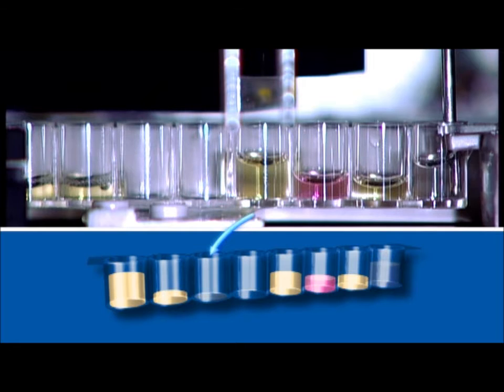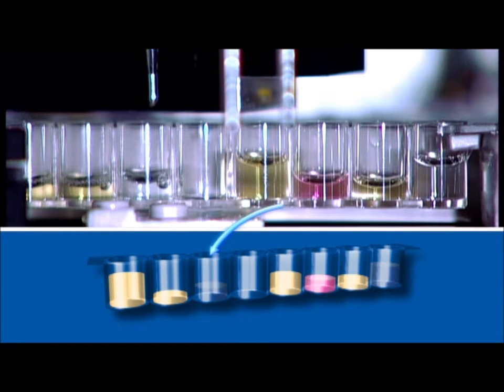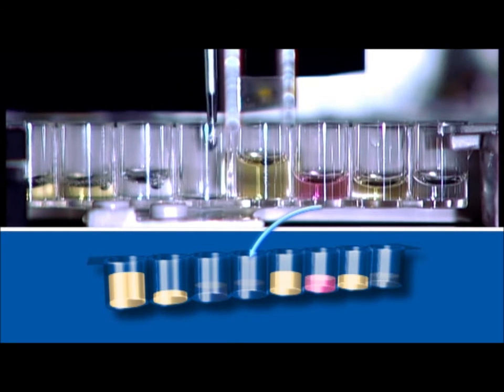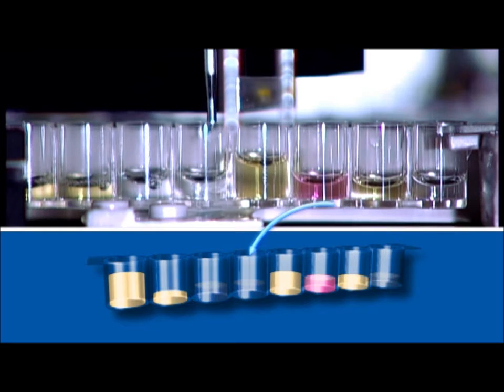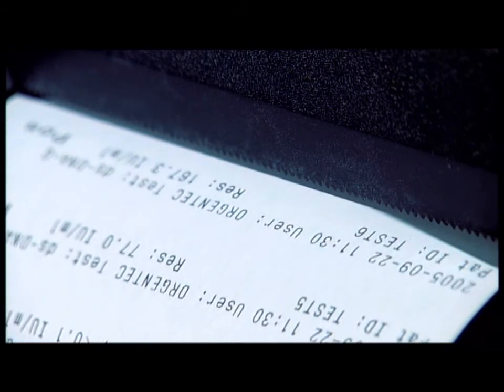And in the seventh step, it pipettes the substrate into the sample cavity. Then in the eighth step, the optical Allegria unit reads the optical densities and Allegria calculates the results. In the ninth step, Allegria prints out the results or, if desired, transmits the data to the lab computer in the tenth step.